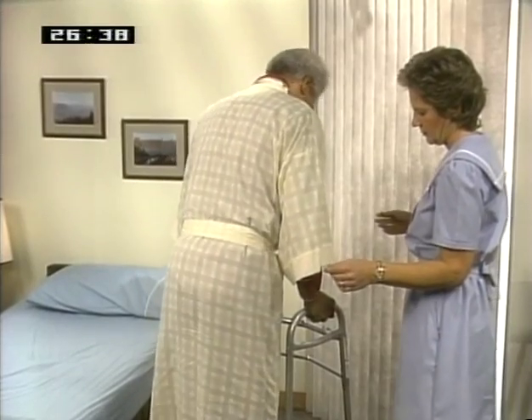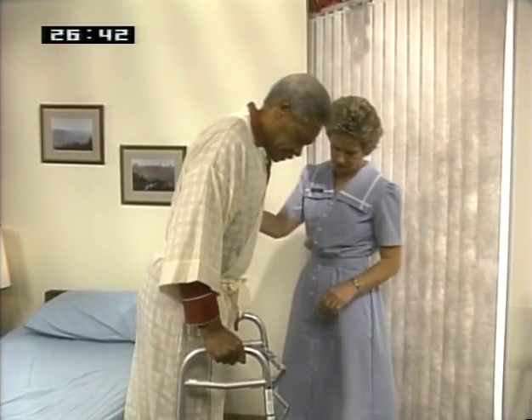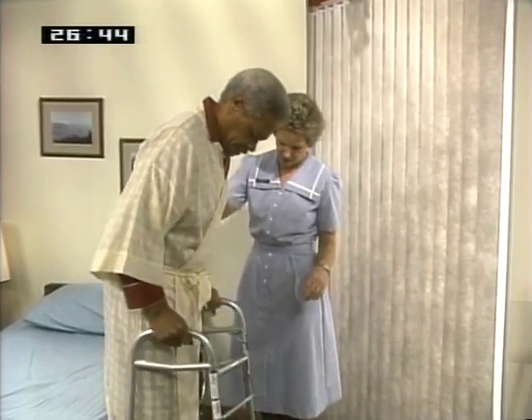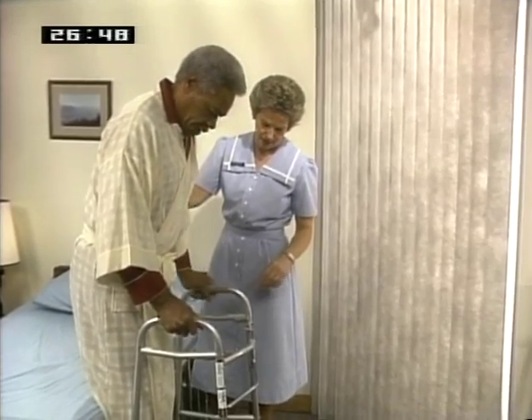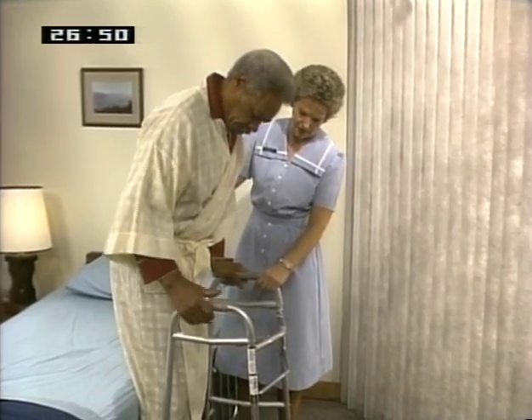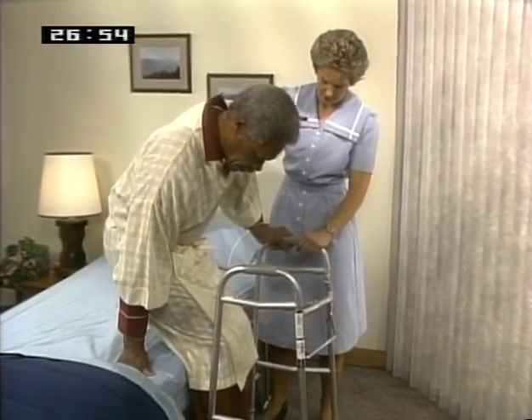Encourage the patient to take his normal steps. Walk slightly behind him, ready to provide assistance or support. Remind the patient to stand tall and look straight ahead as he walks. Assist the patient to turn with the walker and back up to the bed until his legs touch the bed. If necessary, support the patient as he sits down.